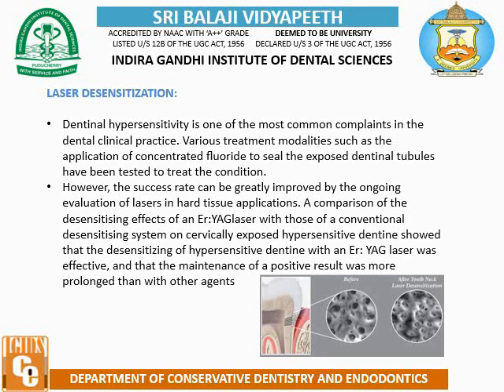A comparison of the desensitizing effects of an Er:YAG laser with those of a conventional desensitizing system on cervically exposed hypersensitive dentin showed that the desensitizing of hypersensitive dentin with an Er:YAG laser was effective, and the maintenance of the positive results was more prolonged than with other agents.